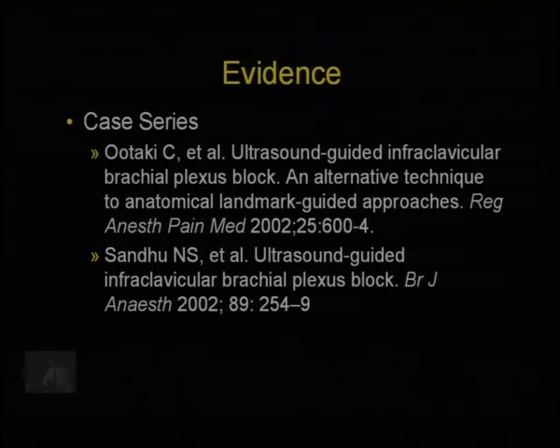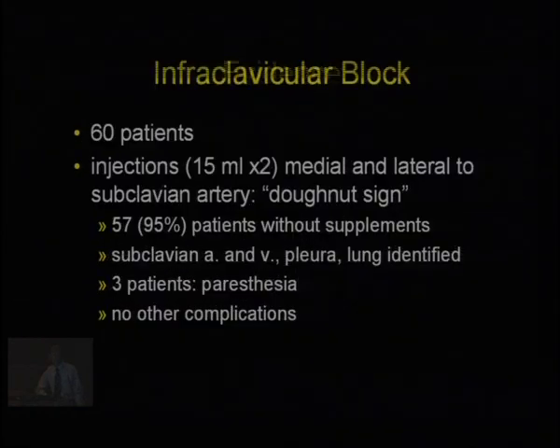There is evidence also from case series. I selected 2 case series which highlight the development of ultrasound-guided regional anesthesia. They are both done on infraclavicular nerve blocks. Now, the first series is 60 patients. It's actually done by a Japanese group.